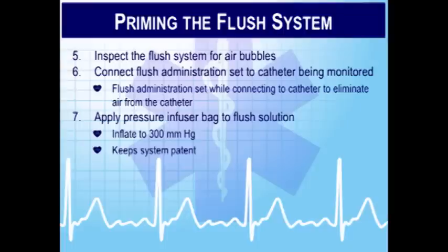So while we don't care about little air bubbles with IV tubing, we do care a lot about air bubbles in these transducer systems. When they're set up and flushed, we're going to take a lot more care to make sure there are no air bubbles in them. Even little teeny tiny air bubbles can have a negative effect on the waveform. If I'm monitoring an arterial blood pressure where the pressure is 120 over 80 or 190 over 70, a little tiny loss of integrity isn't going to be a big deal, right? If the blood pressure is reading 150 and it's really 158, who cares, right? But if I'm monitoring a pressure in a chamber where the pressures are really low, like 3 millimeters of mercury, a little tiny air bubble is going to have a bigger effect on that situation.